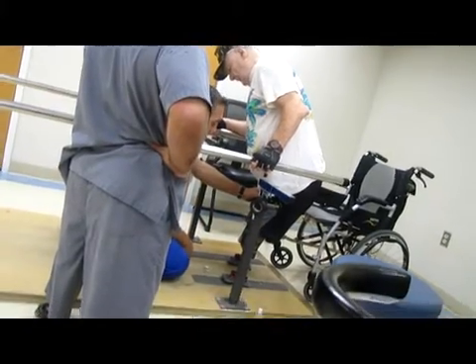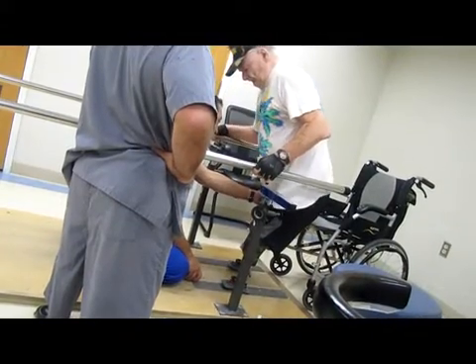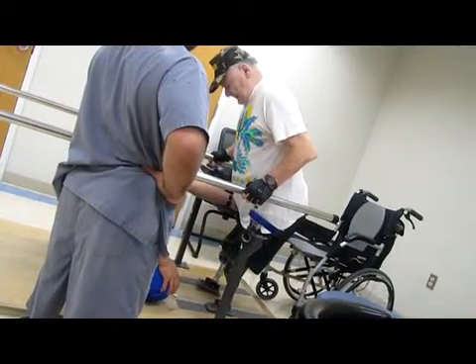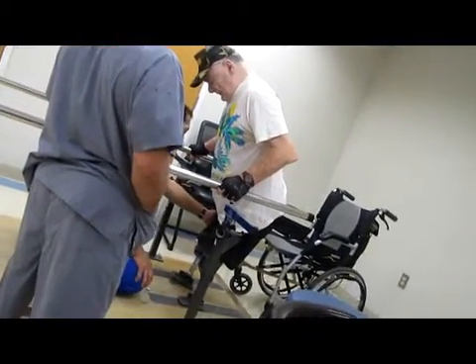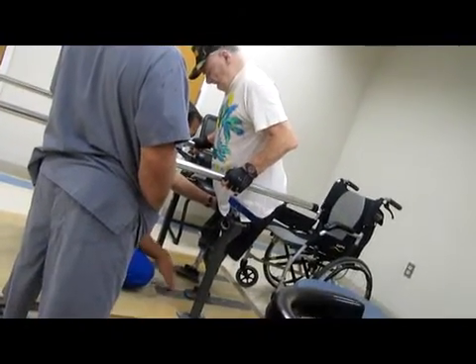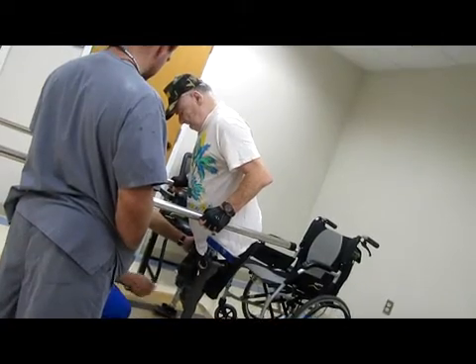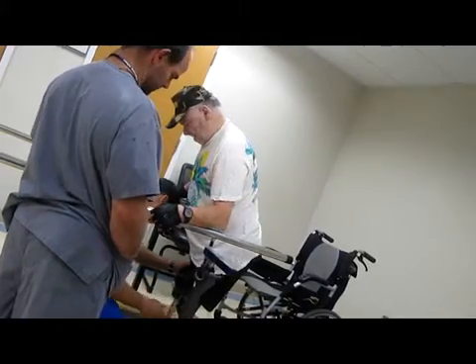Okay, I'd like to see how it fits with the shrinker on only. Can you stand up and kind of get your balance, or is it hurting too much? Well, it's hurting, but it's entirely new, and I haven't been walking for about 5 months. Yeah, so getting balance and everything. I'm thinking let's put that gray metal piece on this side. This side might be fine, or maybe we could put the blue one over here.